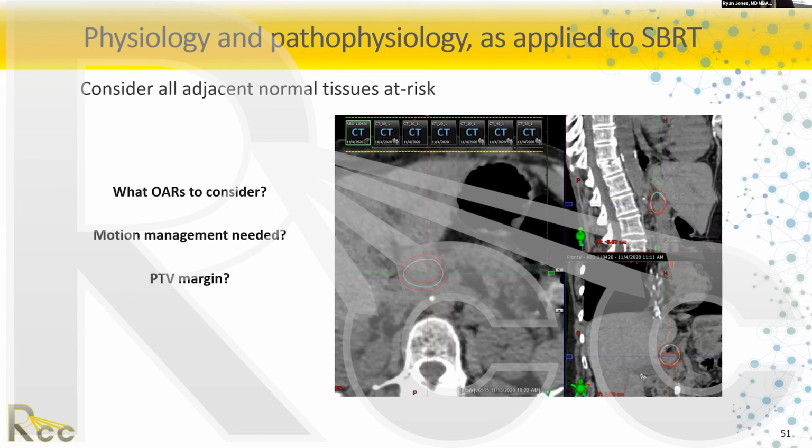I felt like with cone beam, I'd be able to see it and be very careful. And I was worried about central bile ducts. That's an OAR to consider here. And so I used 3 millimeters. I would have used a little more if I could have, or if I felt comfortable, I wanted to be as careful as possible. This was an oligometastatic lung case.